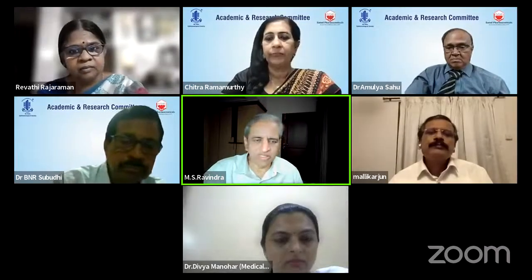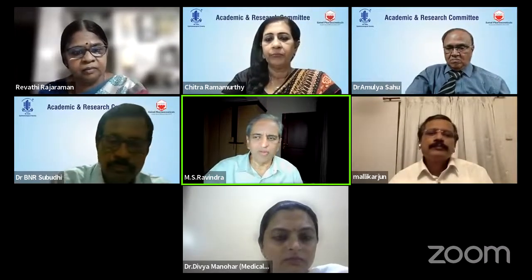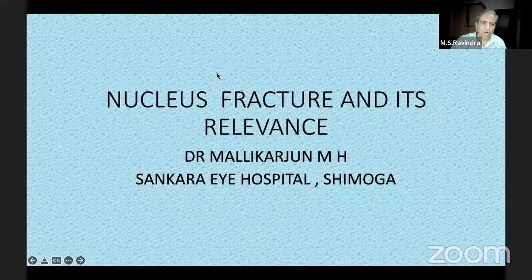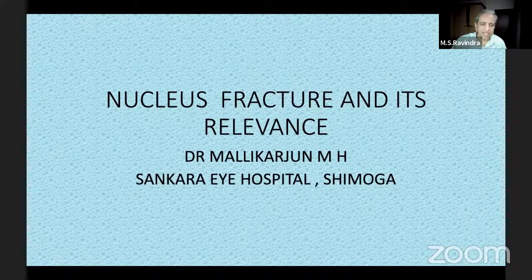Yes. About the tunnels, I think Dr. Divya beautifully presented her submission. But one thing I would recommend is, if there is a premature entry or premature exit, then instead of going to another place, you can start in the same place again, go up or below the initial tunnel, and then you can complete it in the same way. So that's what I just wanted to submit.